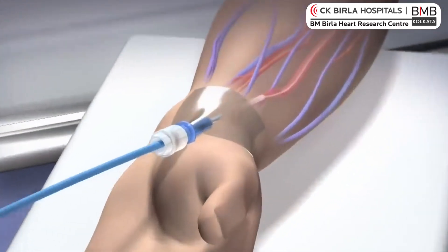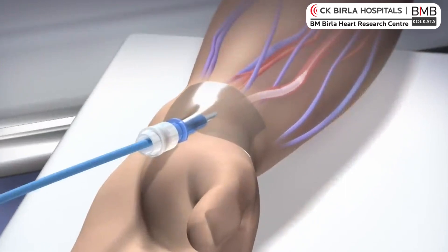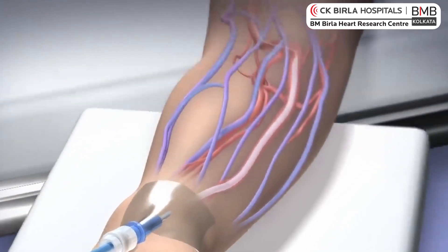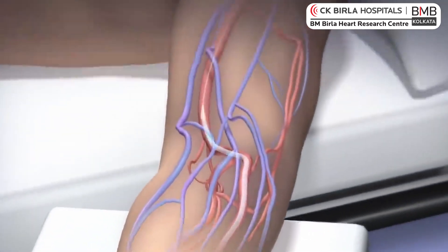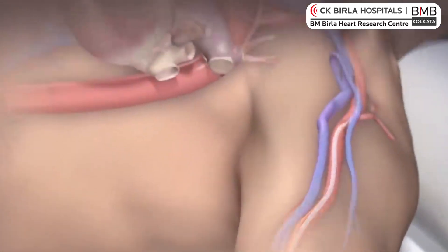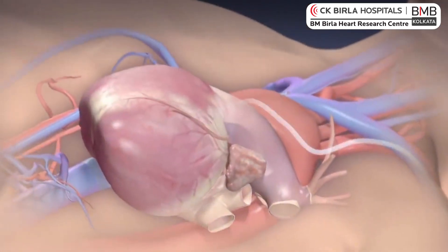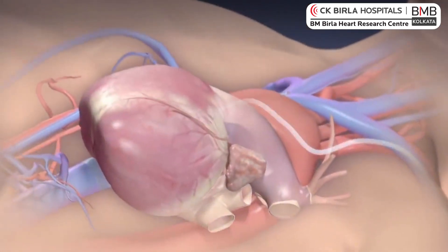The procedure is done under x-ray guidance, and once the catheter is at the origin of the heart artery, we inject a dye into the heart arteries and take x-ray pictures. These pictures tell us if there is any blockage in the heart artery.